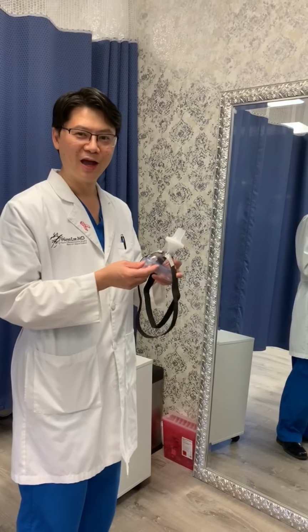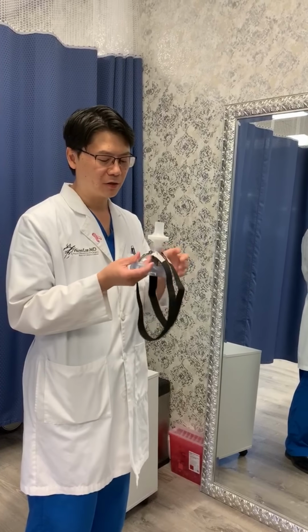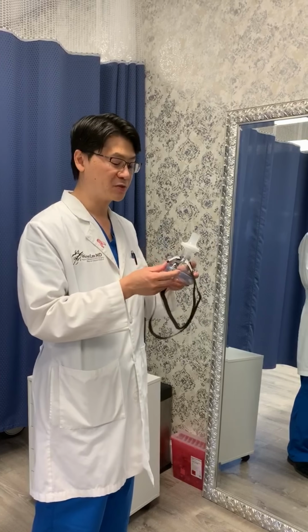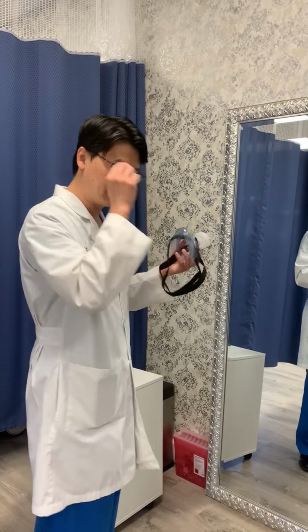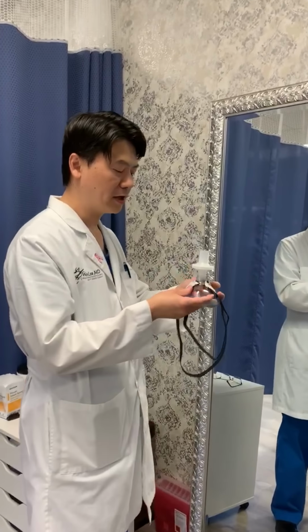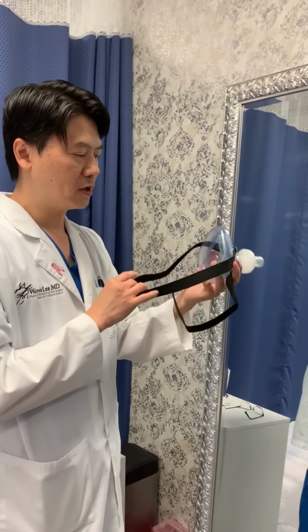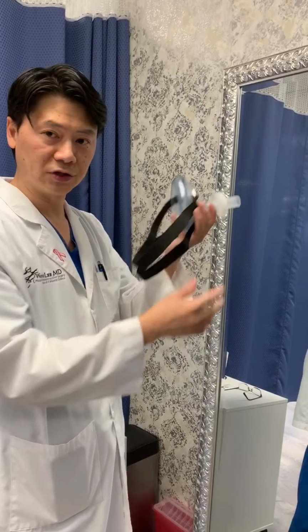Hi, this is Dr. Wayne Lee again. I'm going to show you how to place on this reusable elastomeric respirator. If you wear glasses, it's easier to put it on if you take your glasses off. If you have long hair, put it in a bun. It'll make it easier. So with your non-dominant hand, you want to hold the mask and the filter.